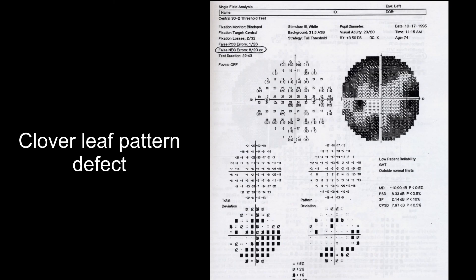This is a typical pattern that we see in patients with high false negatives. As you can see, the patient responded to the four initial points and then stopped responding. This is called cloverleaf pattern defect, which is typical for false negative.